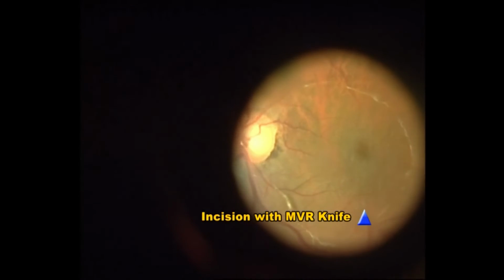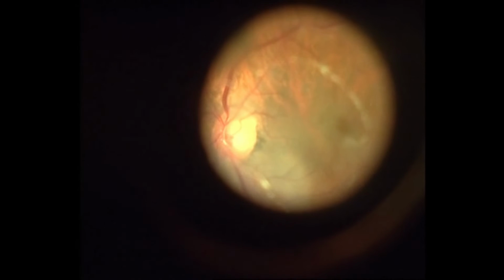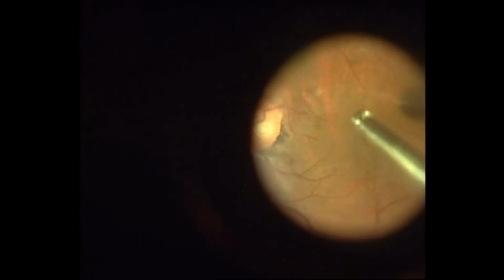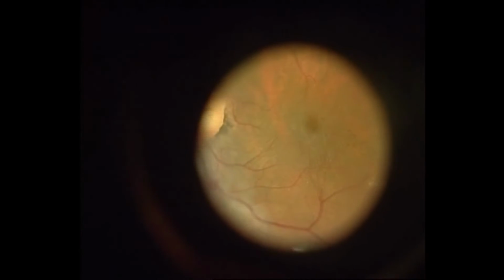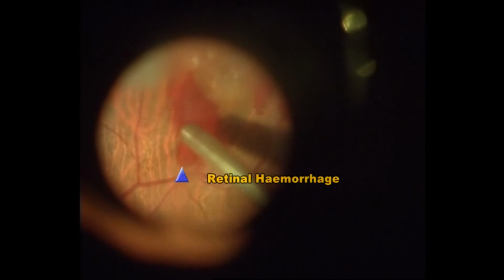An MVR blade is used to rip it open, and a blunt spatula is inserted underneath to lift up the membrane to complete the posterior vitreous detachment. Inferiorly, the PVD induction results in the development of retinal hemorrhage and 2 areas of retinal tears, as well as a localized retinal detachment.